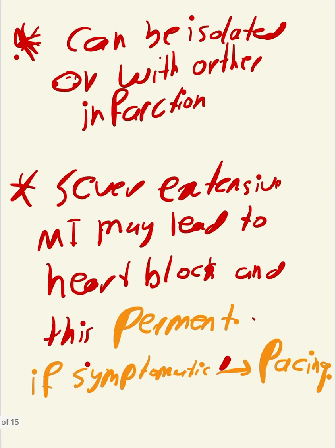Anterior septal MI can be isolated, or with other wall infarction. Maybe there is inferior infarction and anterior septal infarction. Okay. Great.